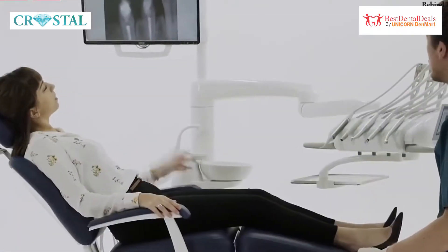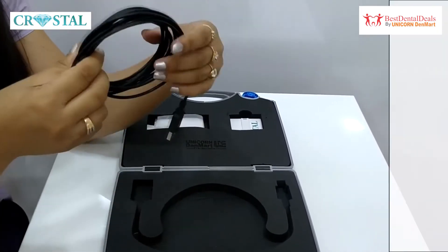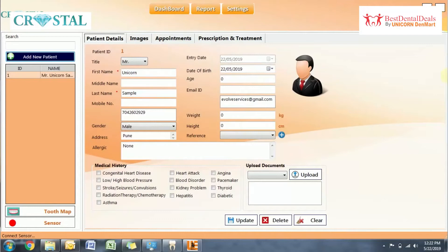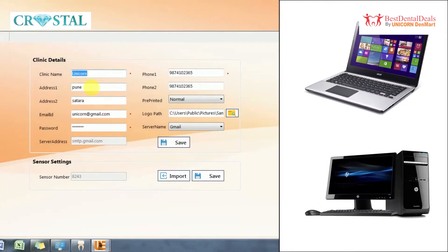The latest in imaging technology, the Crystal RVG comes with a CMOS sensor and a USB port which can be inserted into your laptop or desktop. It also includes a pen drive with Crystal RVG customized software and a calibration file, which is required to install the software on your laptop or desktop.